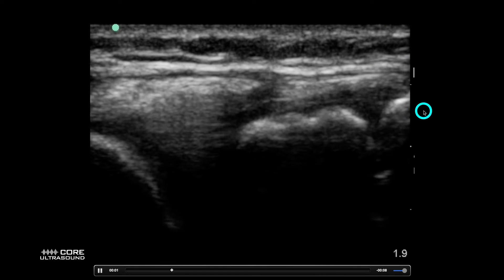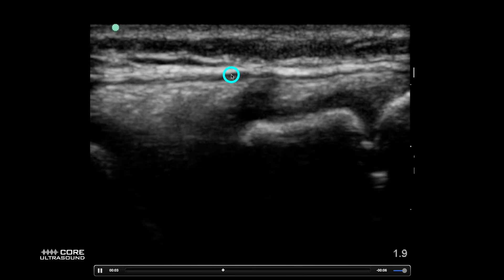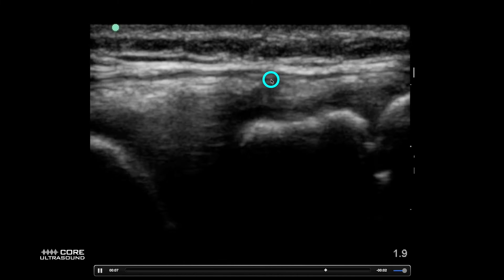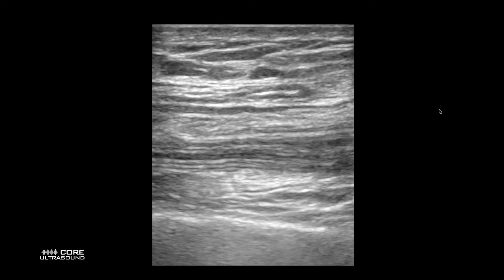Over here we're seeing another example of an LCL tear. We're seeing a disruption in the fibers right here, and we see some fluid right in this area. This is what an LCL tear looks like.